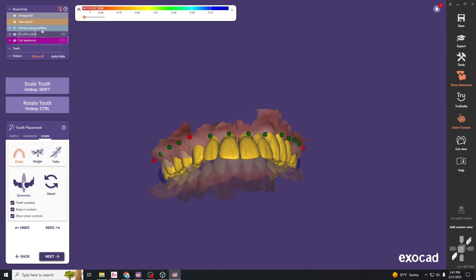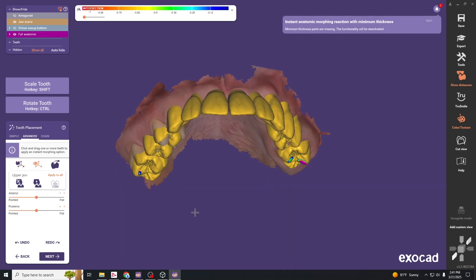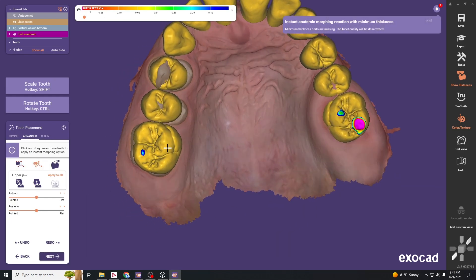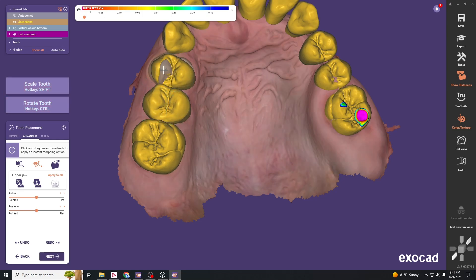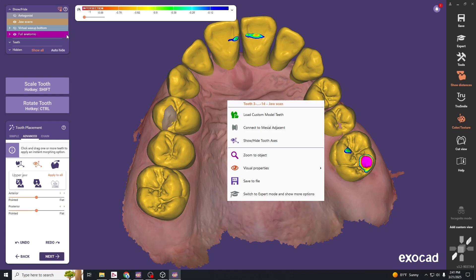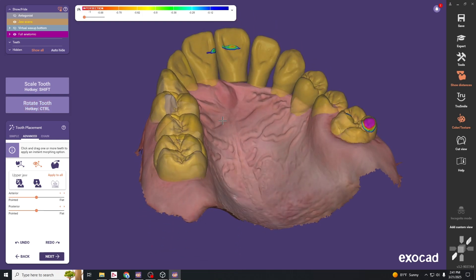That gets us pretty close. From here we jump into the advanced tool and start to scale our teeth into the right position. Clicking and dragging moves the tooth; control rotates it; and control-shift together scales it in the direction the arrow is pointing. These teeth overlying the natural teeth need to be much wider than normal to fit over the top like a snap-on smile. Use transparency to confirm the teeth are in the right orientation.